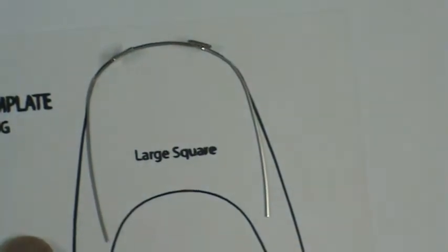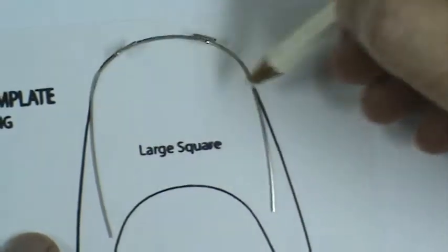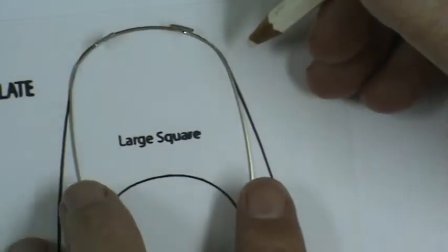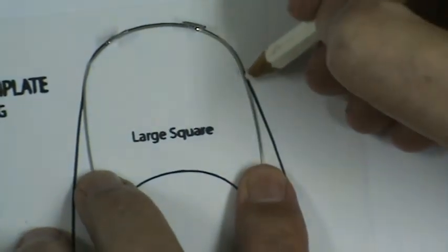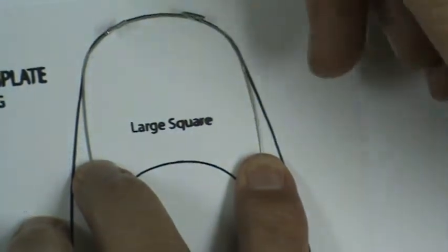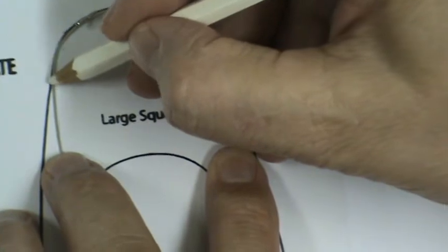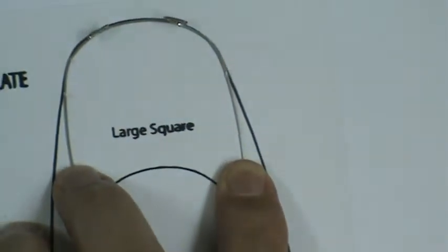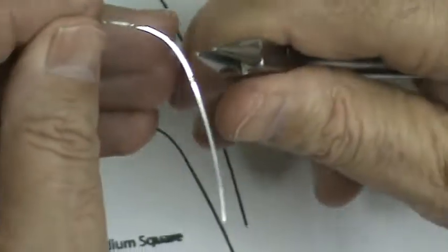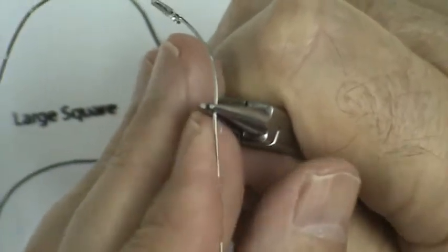Okay, so we now have the curvature correct to this point, and now we're going to bend the wire out straight. So again, I'm going to mark where the wire diverges. You might want to erase your first mark so you don't get it confused. And on this one, I will put the round end on the outside, and then bend it out.